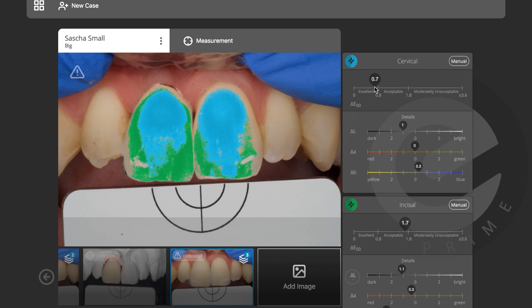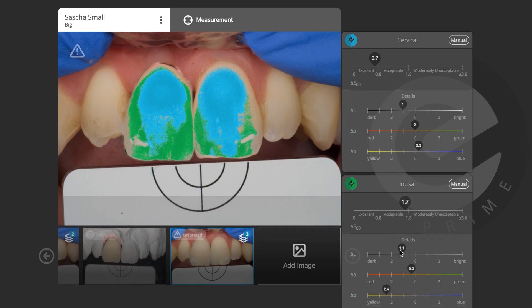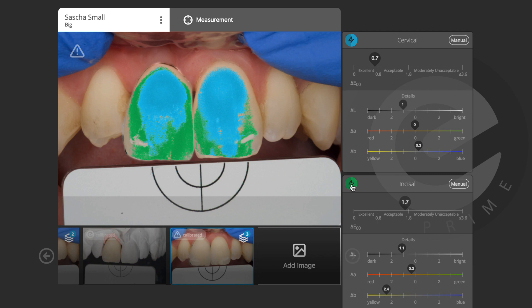The incisal edge is delta E 1.7, which is still acceptable. Delta L is -1.1, delta A is 0.3, and delta B is 2.4 — it could be a little less yellow, but I'm still happy. The incisal measurement shows green going up as well, so I wouldn't be too worried about the 1.7 delta E — it will likely be even better in reality.